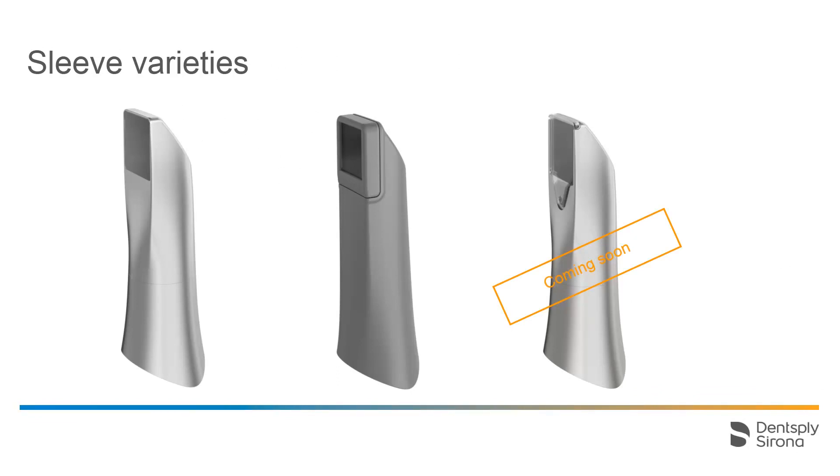There are three different types of sleeves in total. To the left, the window sleeve with coated sapphire glass is displayed. In the center is the disposable sleeve, which is changed after each patient. On the right, we have the autoclavable sleeve with a disposable window. The disposable window is also changed after each patient. In this demonstration, we turn our attention to the window sleeve with coated sapphire glass.